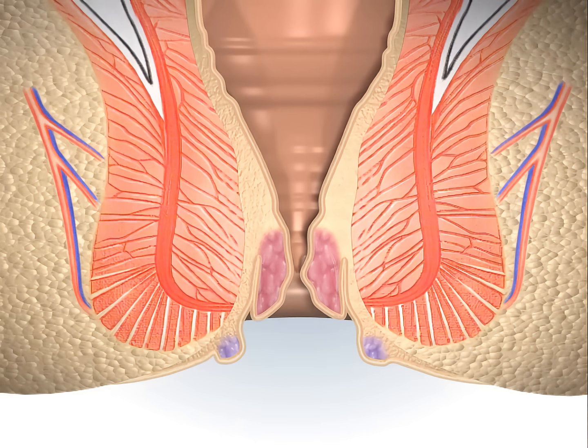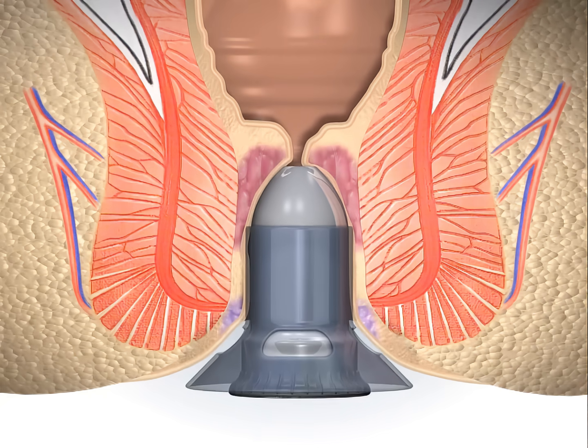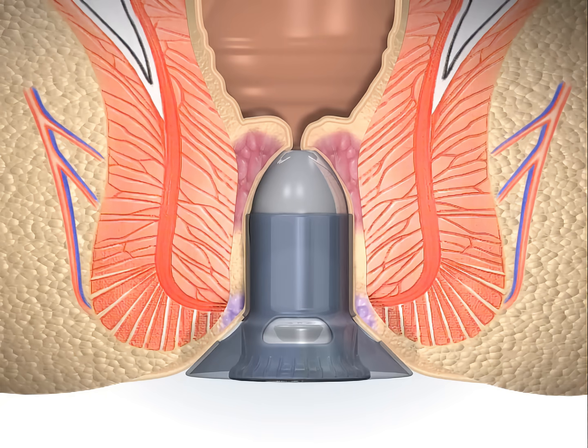This will help to prevent damage to the internal sphincter. The obturator is then removed and the circular anal dilator with the obturator in place is inserted. This pushes back the mucosal prolapse into the anal canal.